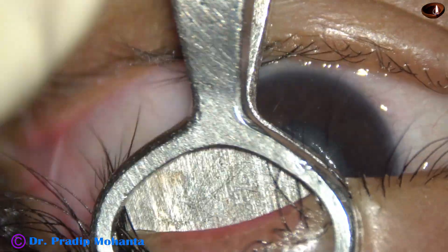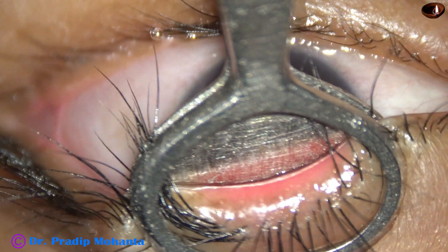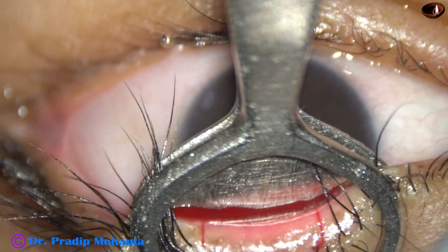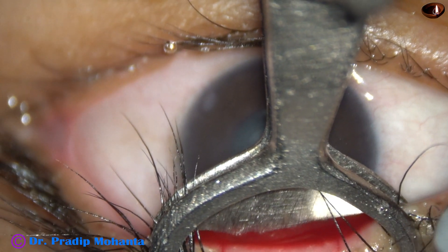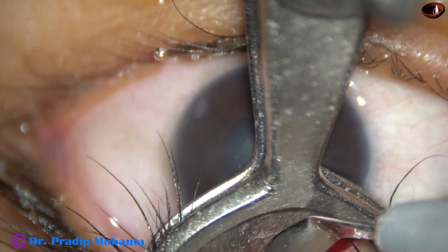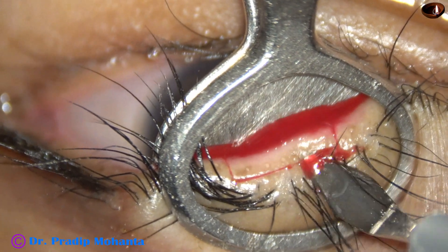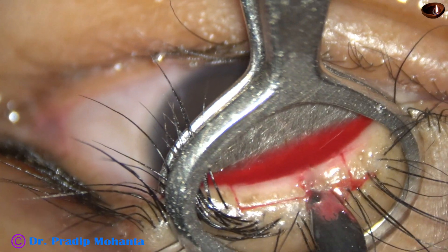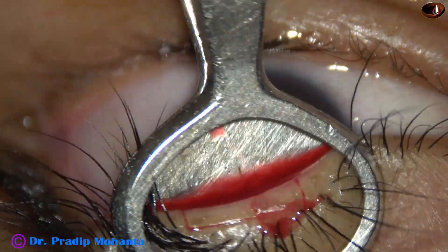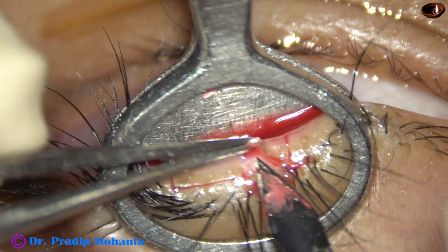I am using chalazion forceps — the part which is open is above and the part which is solid is below — and I am using a keratome to cut the eyelid margin. The transition tissue where the skin of the eyelid becomes the palpebral conjunctiva is being excised.